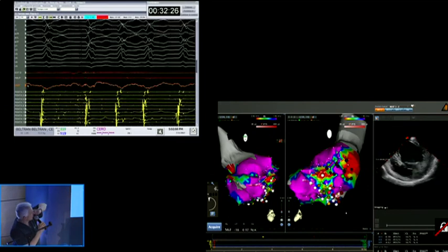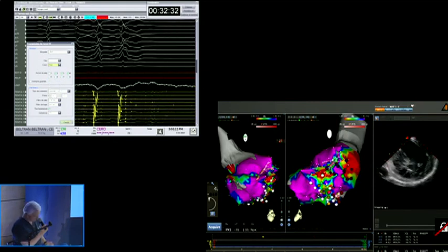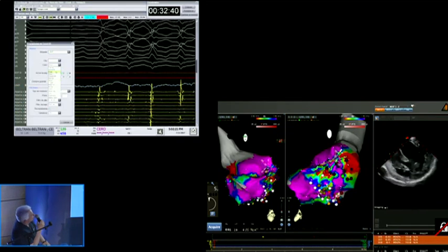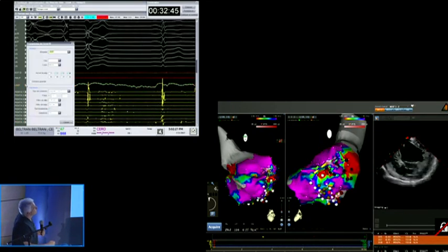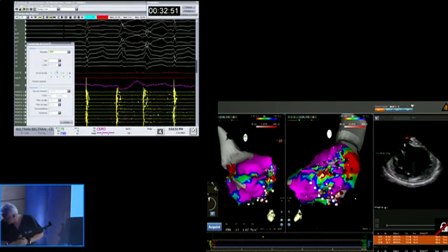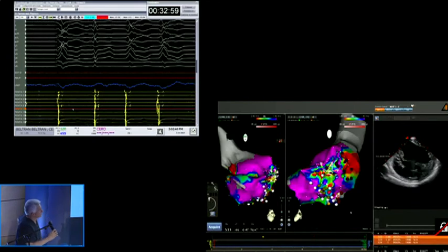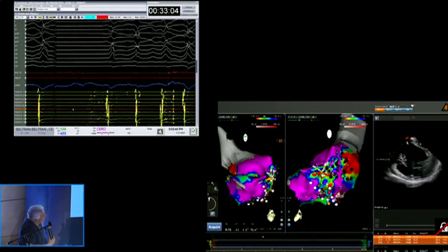This area is all abnormal. And it looks like there is a channel between both scars. Do you see that? Red, and in the middle there is a channel of preserved tissue. Do you see? It should be at the edge here of the normal and abnormal. Look at those. So, tag these late potentials, please. What am I missing? Lift it up a little bit more.